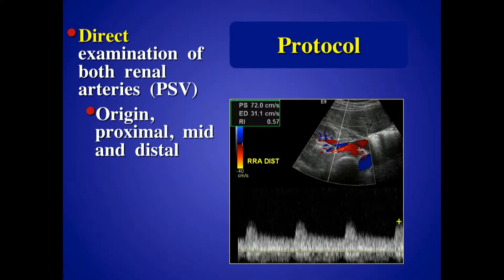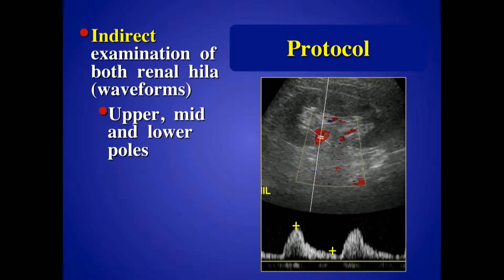We do the direct examination of the renal arteries, getting samples at origin, proximal, mid, and distal, making sure angle corrected, easy to review from each side. Then we're going to take waveforms from the segmental branches inside the kidney to look for changes that may suggest there was an occult stenosis that we missed. Sometimes there are duplicated arteries which may have a stenosis you'll pick up with the indirect exam, or even less commonly a segmental artery stenosis you'll pick up with this test.